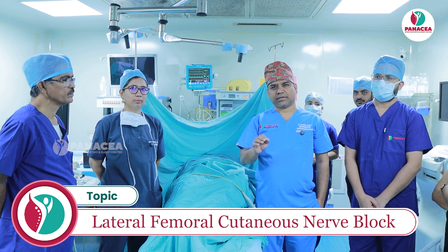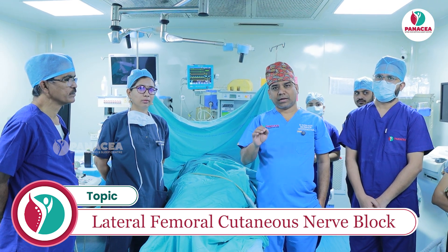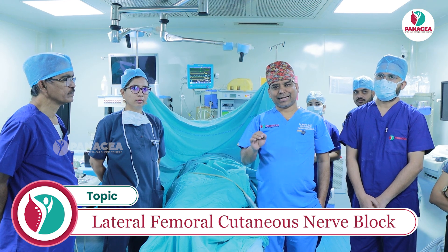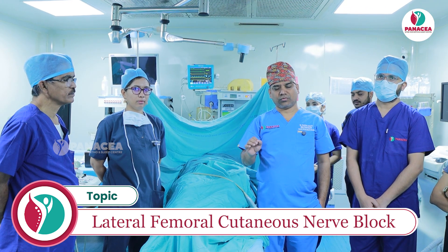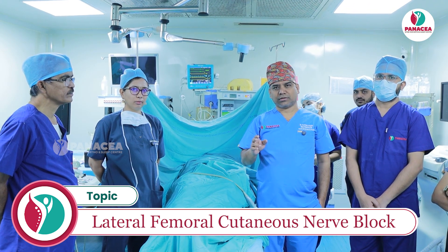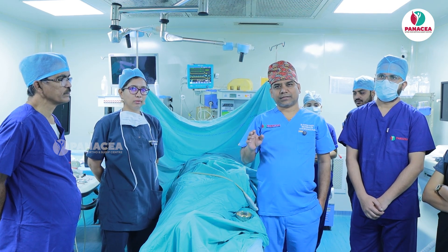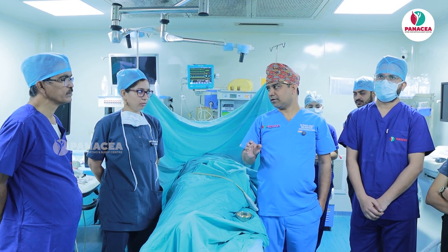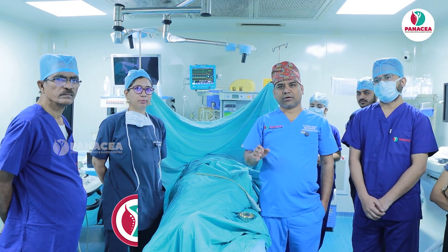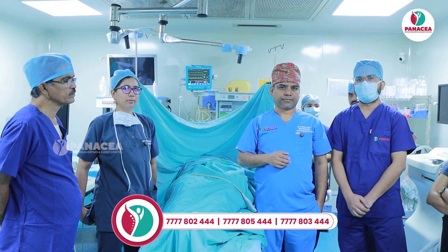We are going to do LFCN ultrasound, as well as a blind approach to LFCN block — that is, the lateral femoral cutaneous nerve. Normally it has a dermatomal distribution on the lateral aspect of the thigh. It is purely a sensory nerve with a root value of L2-L3.